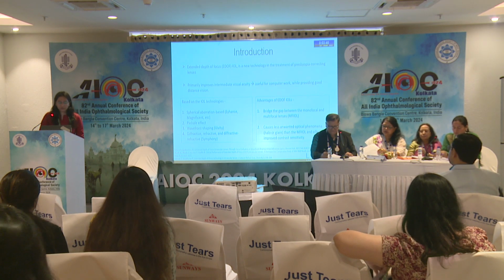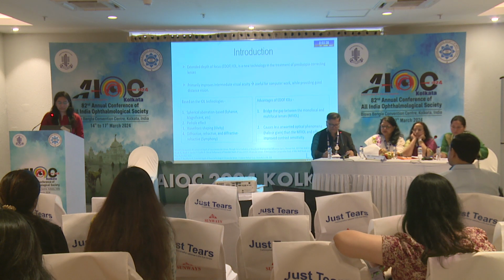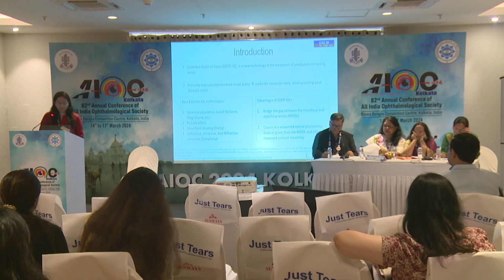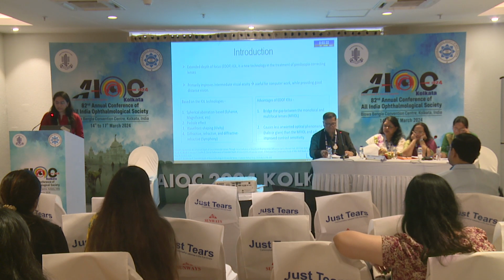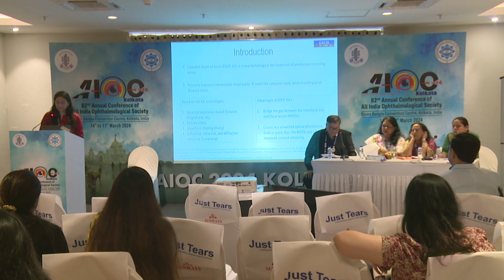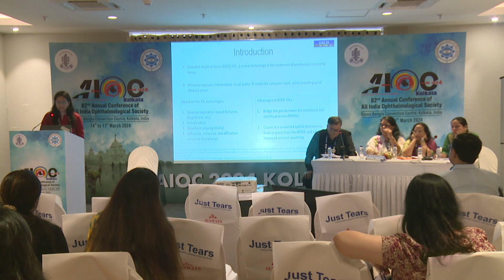Based on IOL technologies, it is grouped as spherical aberration-based, pinhole effect, wavefront shaping, diffractive and refractive types. They bridge the gap between monofocal and multifocal IOLs and cause less unwanted optical phenomena like glare or halos than the multifocal IOLs, and offer improved contrast sensitivity.